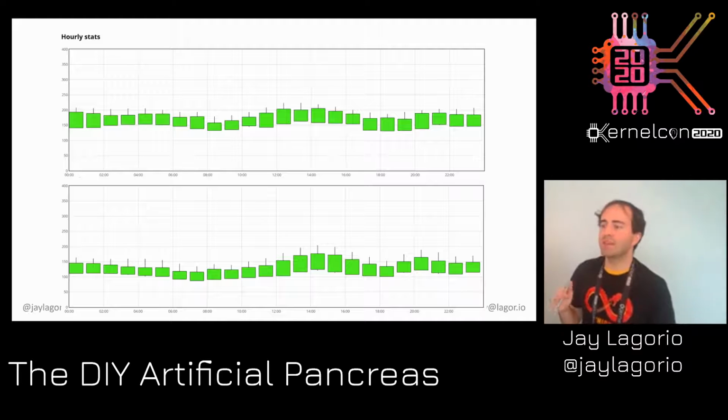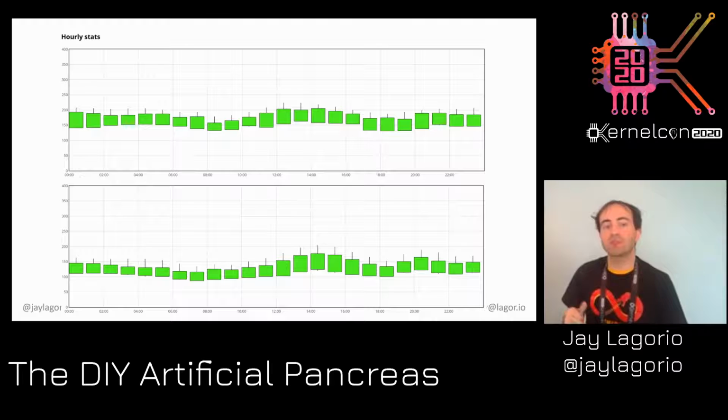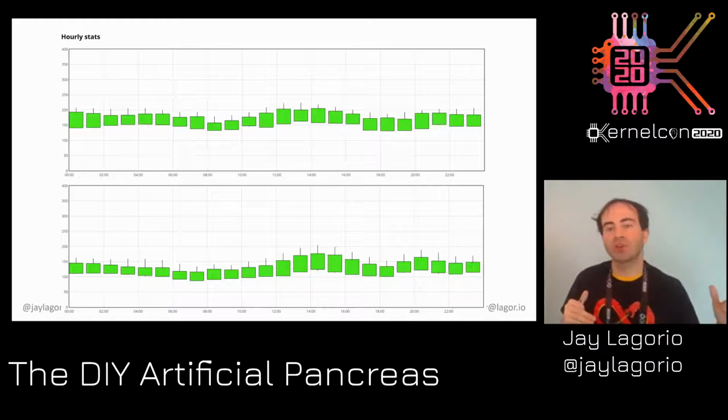Now, this is the same data, but shown as it relates to hours per day. So you see up at the top, the one from 2016, the numbers range largely from 150 to 200, and at the bottom, they range largely from 100 to 150, and you can see those two higher peaks right after lunch and right after dinner. But OpenAPS brings them straight back down pretty quickly, whereas up at the top, it was just all high blood sugar all the time.